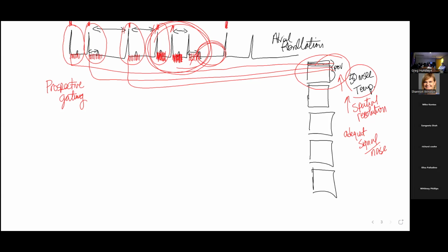That's the first thing. If you put somebody in the scanner and you can't see the triggers, then you've got to come up with a way to do that. If it's a rearrange the leads, that's fantastic. Another thing you can do if they have a regular rhythm is you can trigger off of other things. Sometimes the T wave, we trigger on the T wave. It just needs to be repetitive. Sometimes we take the little pulse oximeter signal and we trigger off of the pulse.